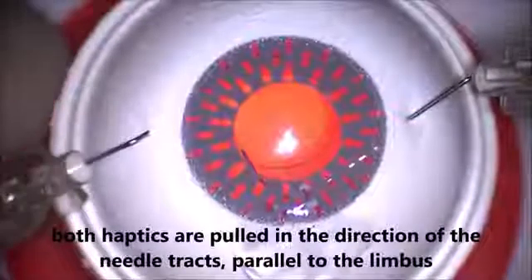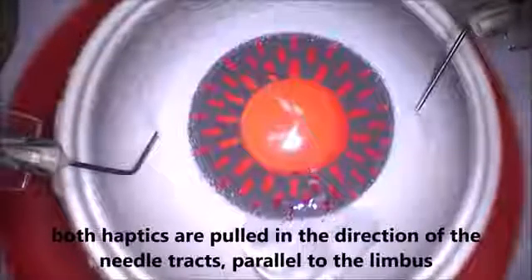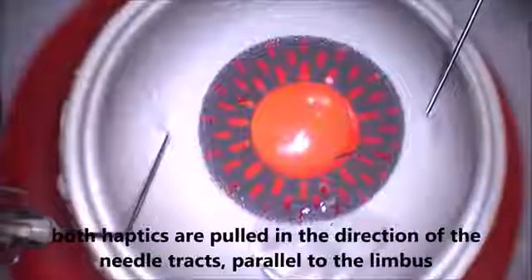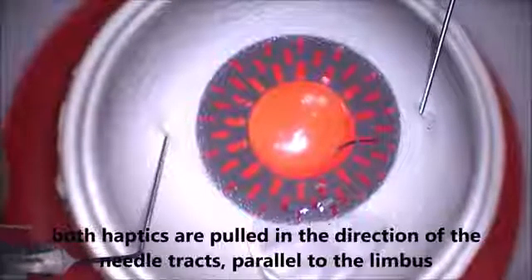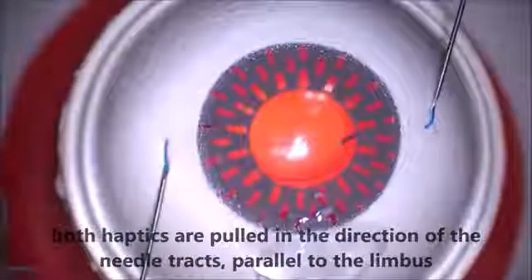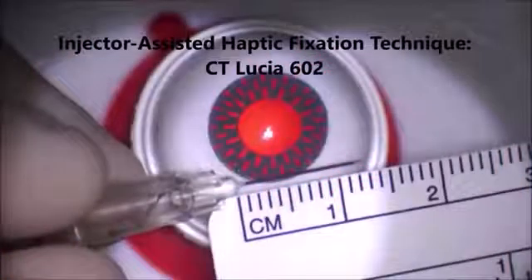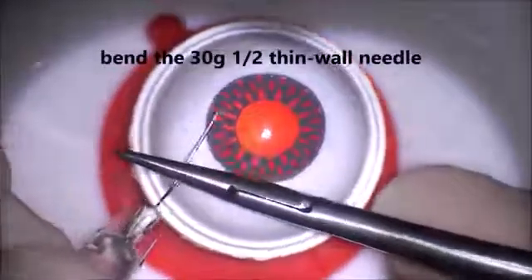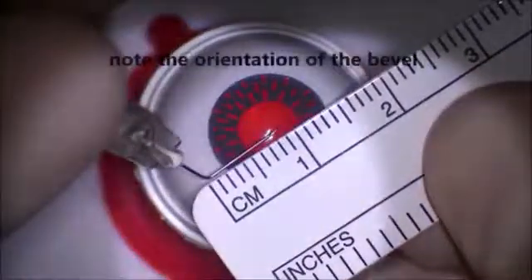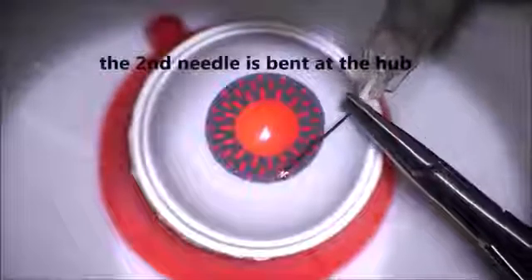I'm showing you the injector-assisted haptic fixation technique that I developed back in 2017, using a Simuli eye with the CT Lucia 602 lens on a 30 gauge half inch thin-walled needle. By using the injector, you're very easily and controllably able to slide that leading haptic into the left side needle. The problem, however, is it's still like the Imani technique in that the trailing haptic is still difficult to fixate. With the model eye I was able to capture the trailing haptic in a U-shaped configuration, though it's still ergonomically a challenge, especially for those learning it. I'm able to dock the haptic on the bevel, turn it, flatten it out, and then advance it into the needle.